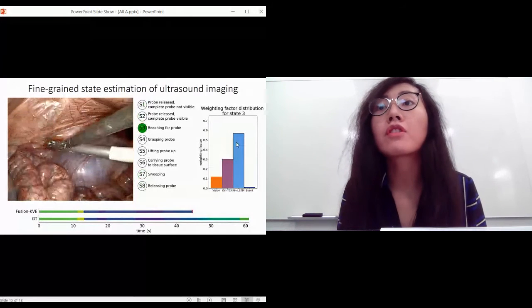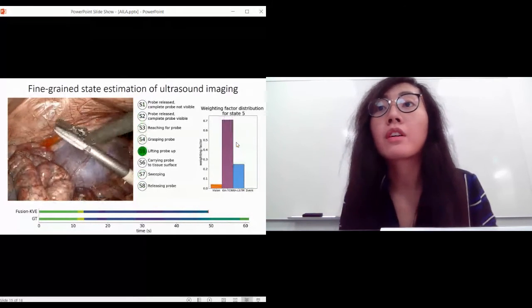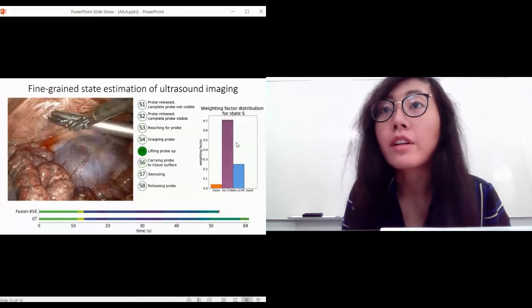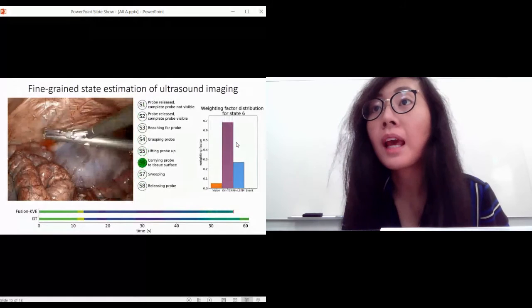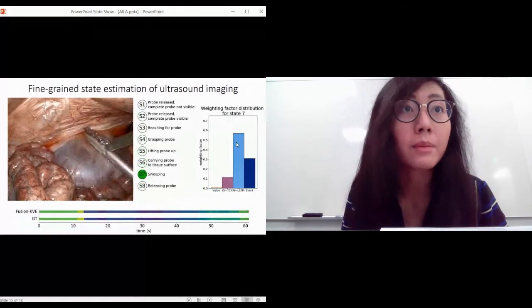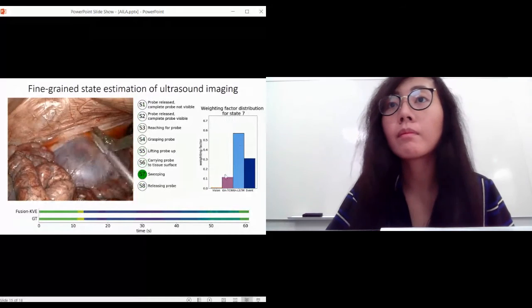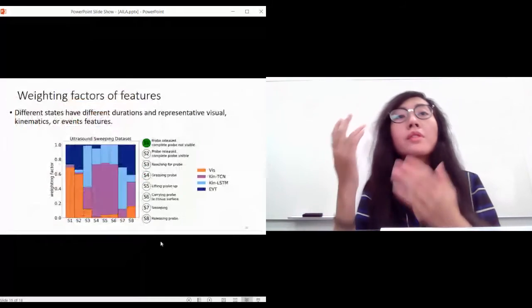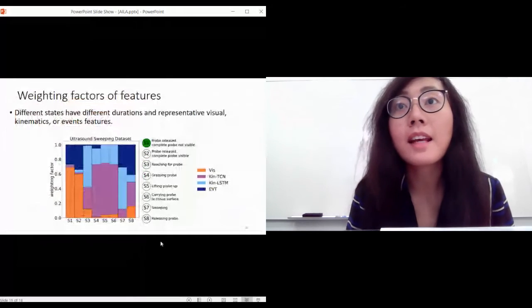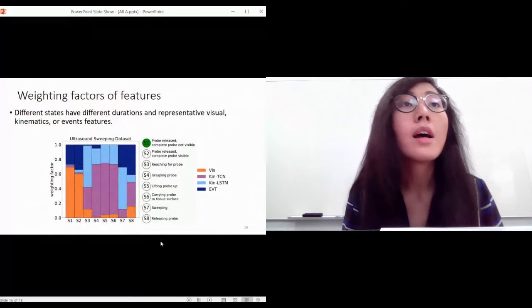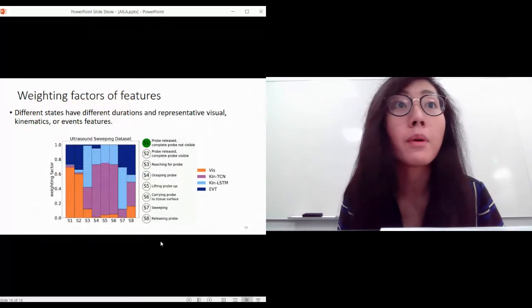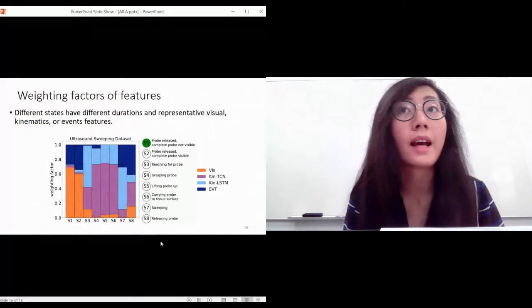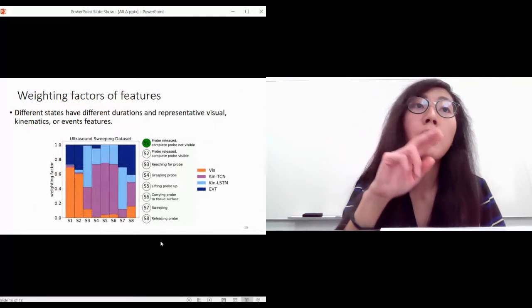This is because the visual features are more predominant between state one and two, whereas for the current surgical state carrying the probe to the tissue surface, and now getting into the sweeping cases, kinematics is more predominant and recognizable with a recognizable pattern. This gives us a more comprehensive view that different states have different durations and different representative visual, kinematics, or event features. Between state one and two, whether the probe is visible in the endoscopic view, vision is predominant with a higher weighting factor, whereas when you're doing sweeping, you're doing this very distinctive motion.